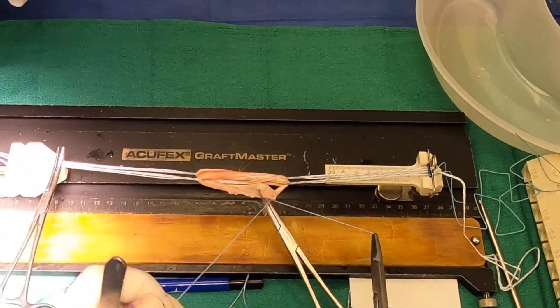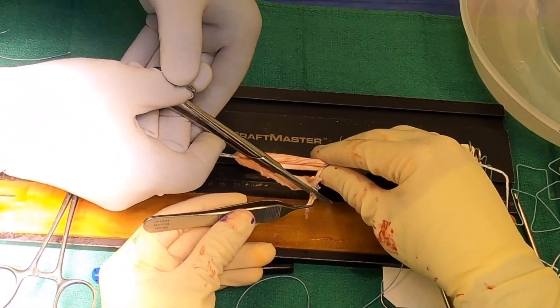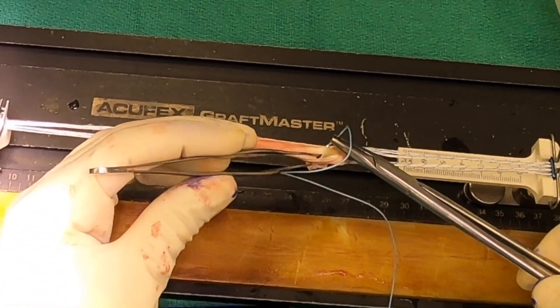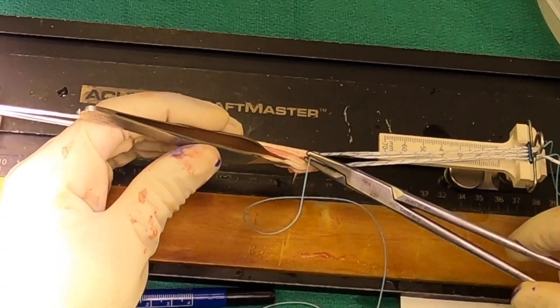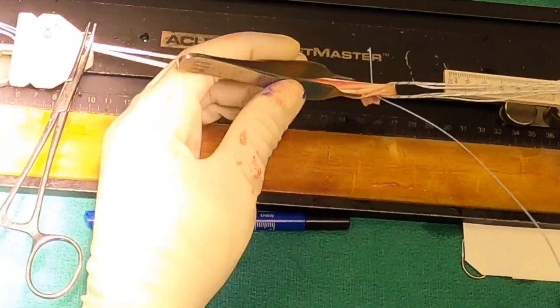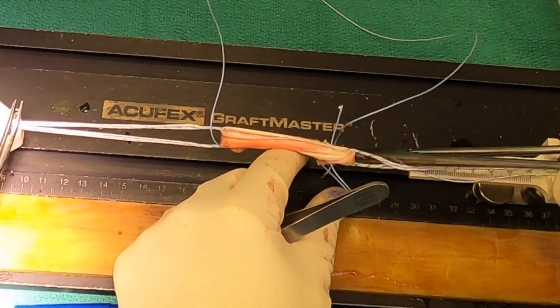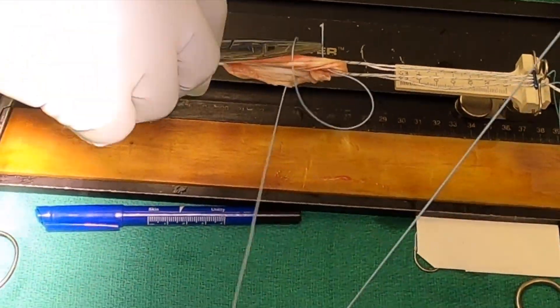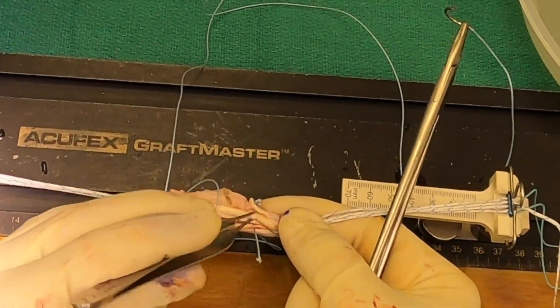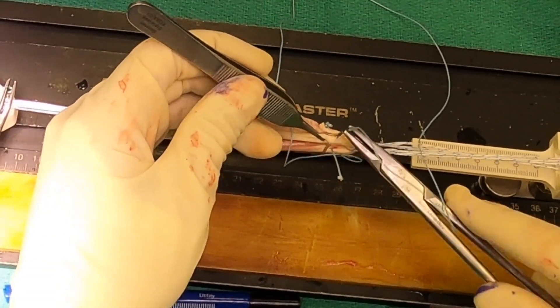At this point we want to get this cleaned up so it's as smooth as possible for graft passage once we put it into the knee joint. Now this is the critical part — we're going to pass three sutures. We start going inside to outside, pull it through, then go over the top of the graft twice. Here — once, retrieve it, go over twice, and now go outside to inside, picking the outer one as the smoother one, so that's what's interfacing with the bone tunnels.